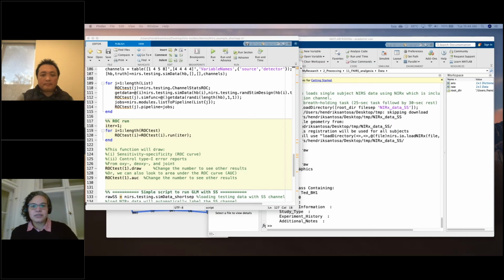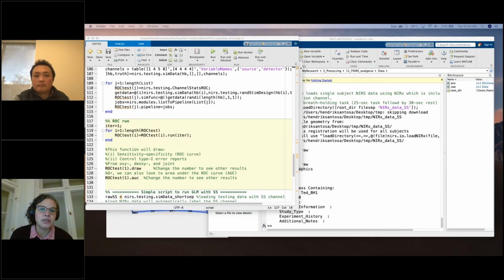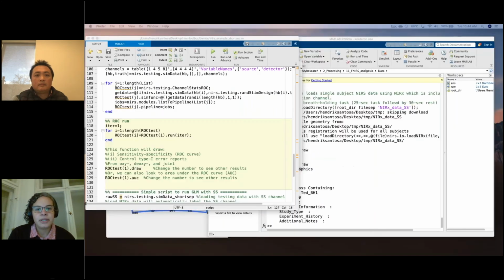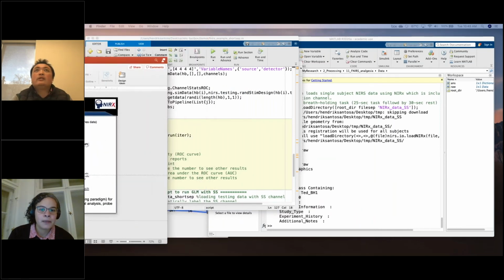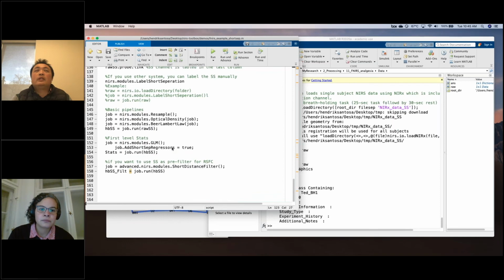One question, which you mentioned just at the end right now, would be how to use the short separation in the resting state data, for example, without the GLM. I guess you said that you should use the filter, right? The filter with the short channel. Yes, I put this one in the toolbox in the demo also.